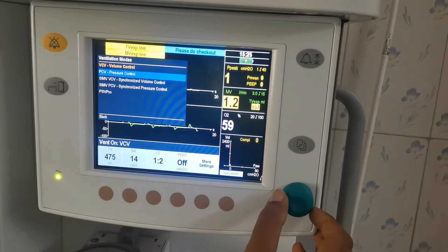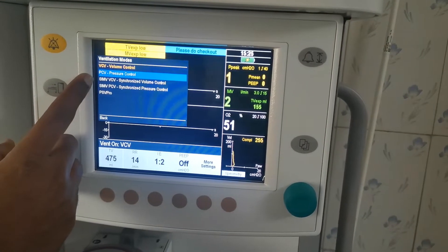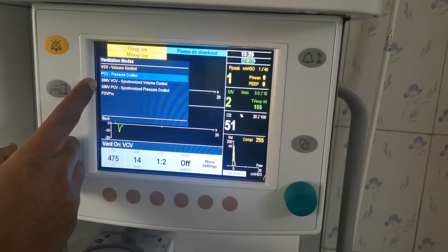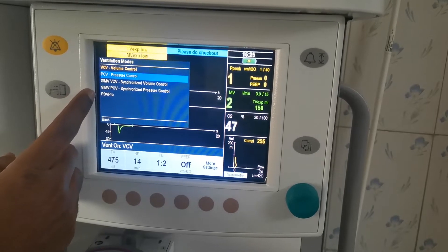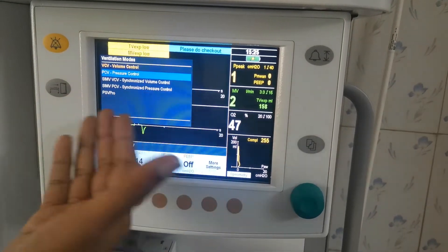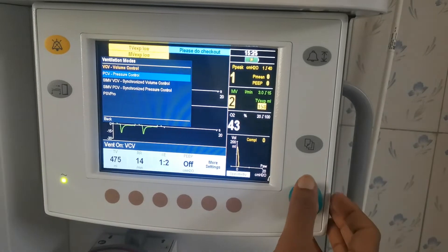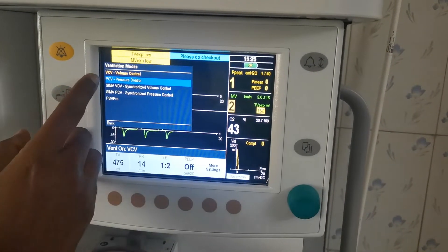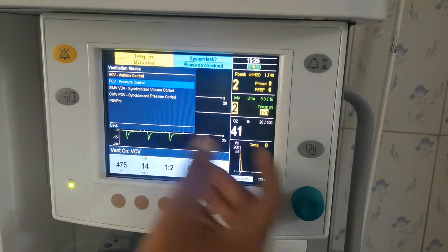We have volume control ventilation, we have pressure control ventilation, and we have synchronized intermittent mechanical ventilation. In SIMV pressure control ventilation — so we have selected VCV, volume control.